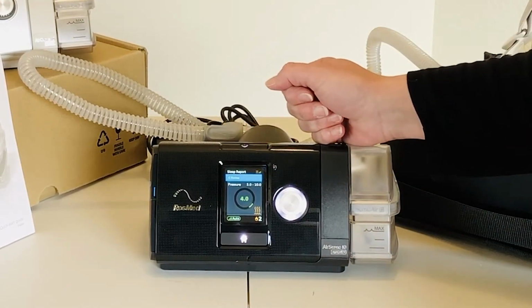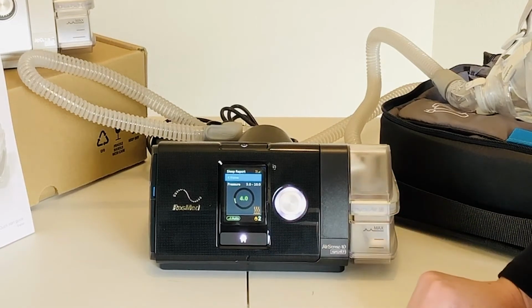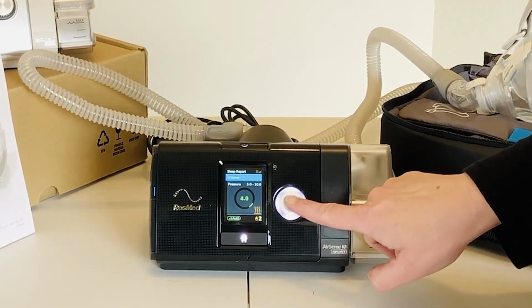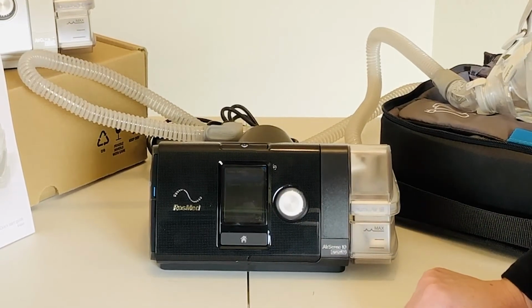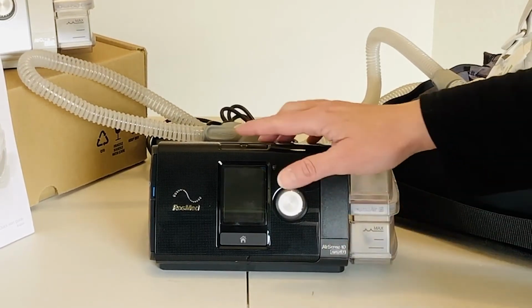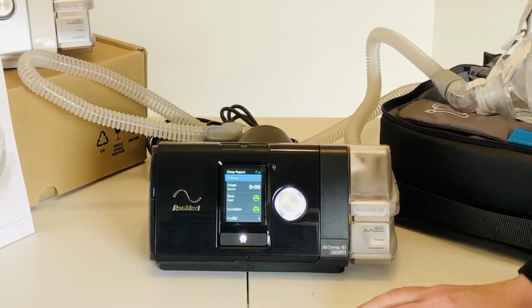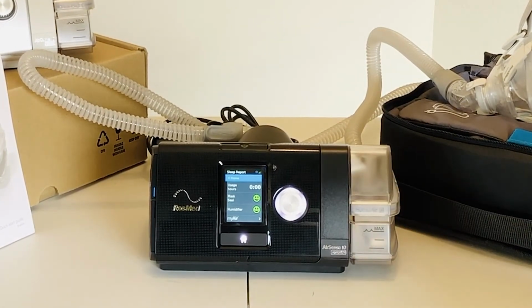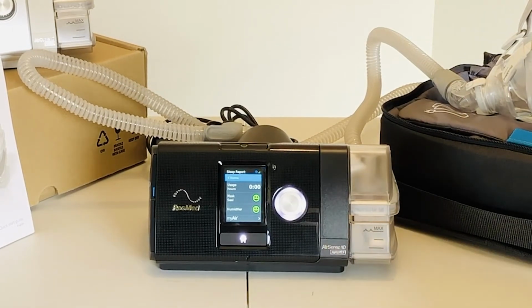physician. Remember, if the light goes off, you may turn it back on by pressing the home button or the silver dial. In the morning, just press your start-stop button once again to shut off CPAP. You will be brought to your sleep report as we discussed earlier.